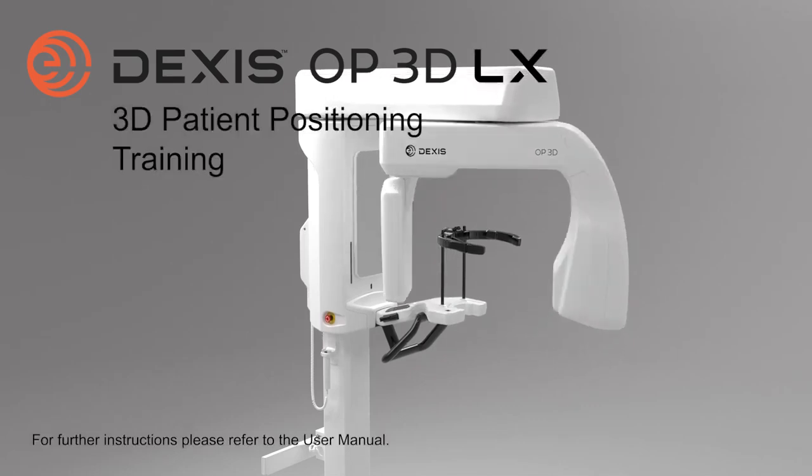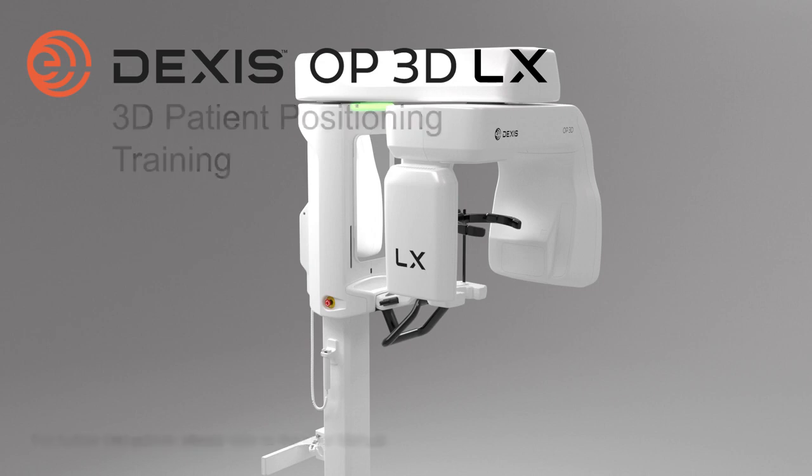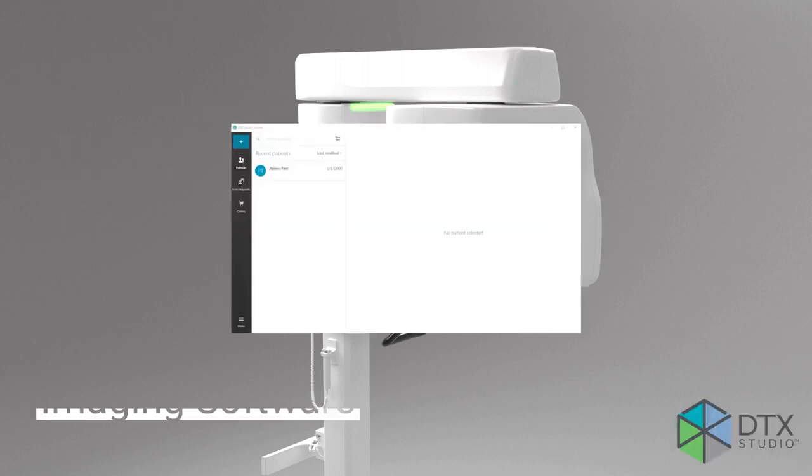Welcome to a DEXIS OP 3D LX 3D patient positioning training video. This video covers scan size selections, proper patient positioning, and acquiring an image. Start by opening your dental imaging software.